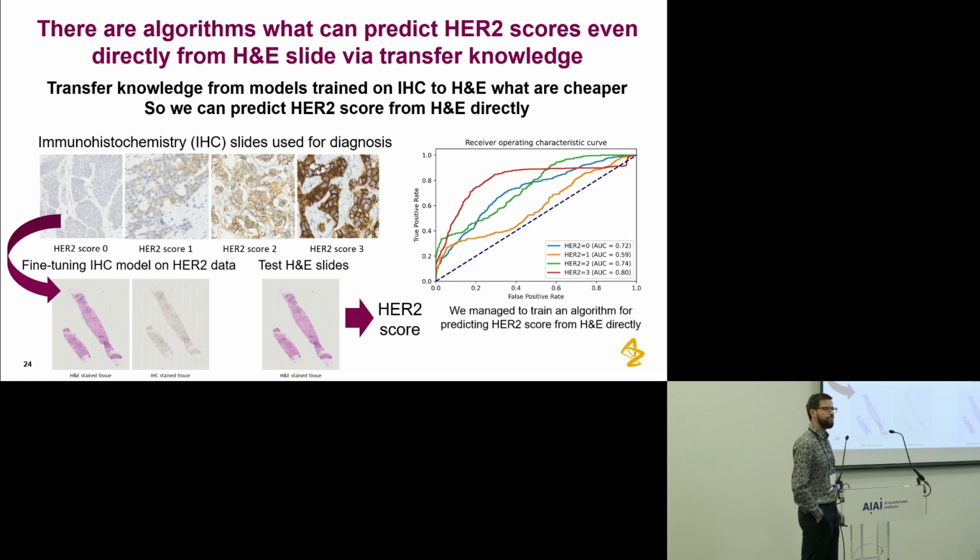One of the issues that we face, and you mentioned this later in the talk, is the variation between different laboratories and between different trials in the type of data that the model receives, right? Do you have any special ways of dealing with this variability in the data? For example, if somebody creates a tissue slice that's 4 micron thick instead of 2 micron thick, or they use a bit more staining, then it really can affect the readout of the algorithm.